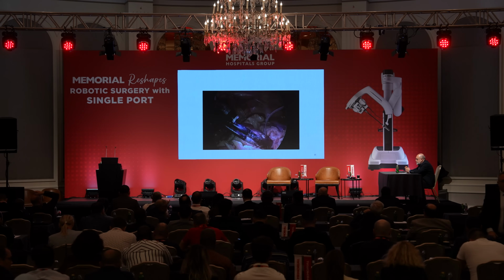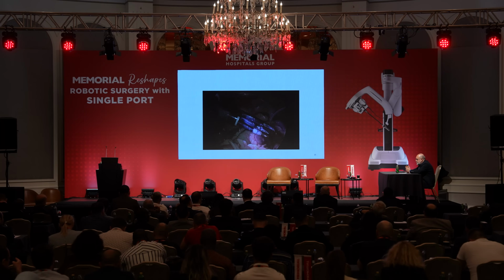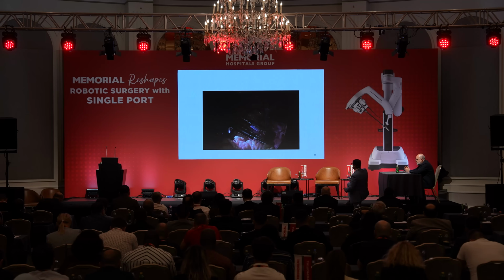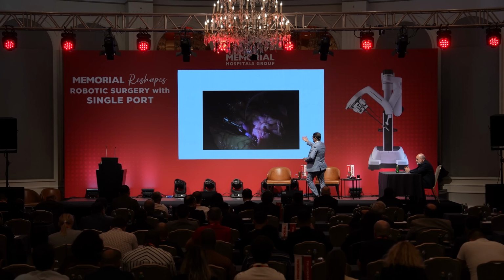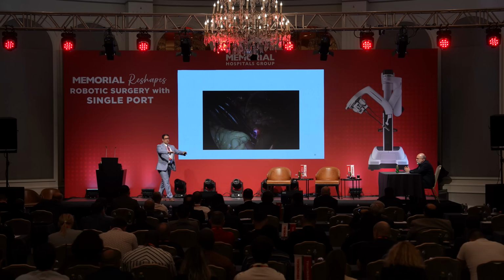So here, when I'm having the vision from up, I cannot see below, and this is the 180 twist that I like a lot about the SP. That twist puts the camera down, therefore I can see everything underneath the mesocolon, and I can finish my dissection.